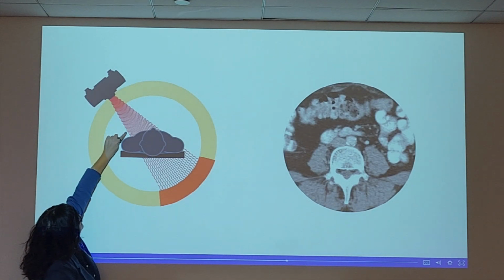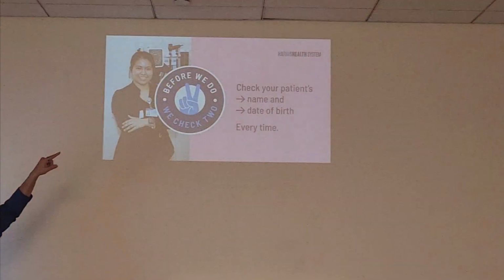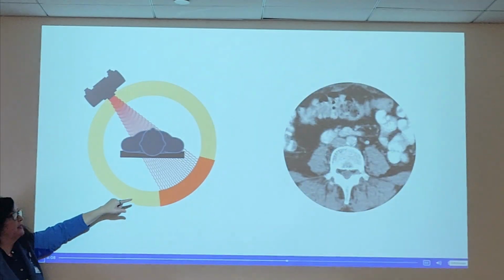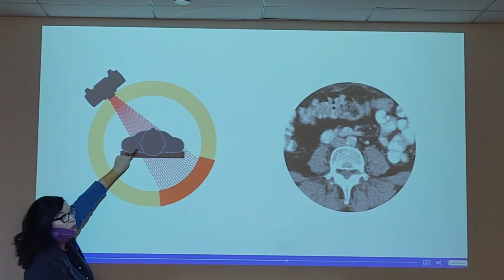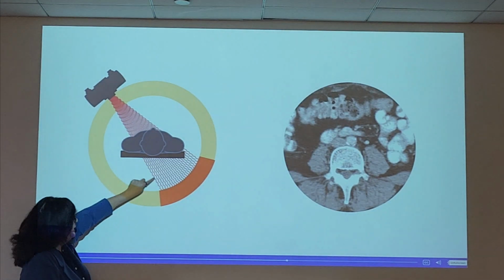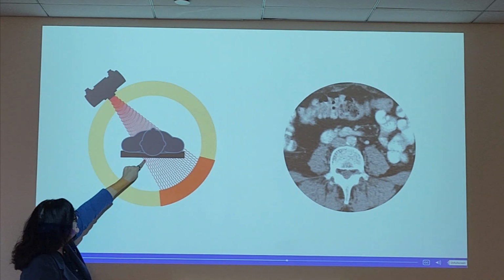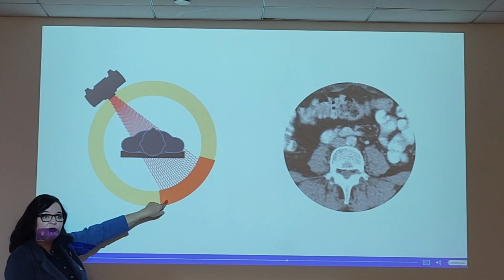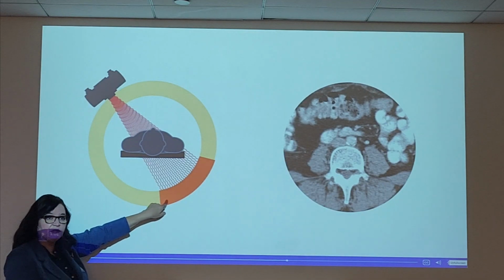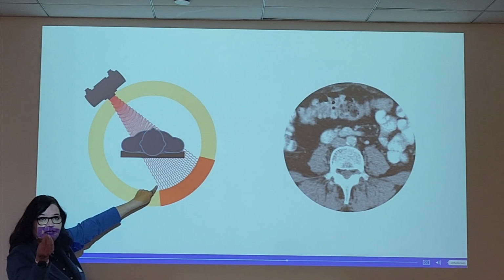If the energy went into the patient and exited the patient, it is not carrying the same energy punch that it did going into the patient. Depending on what this energy collided with in the patient and exited, it does not carry the same energy. But because these wavelengths, or this analog wave, is being captured by the detector, a number is going to be assigned to the intensity, the energy.